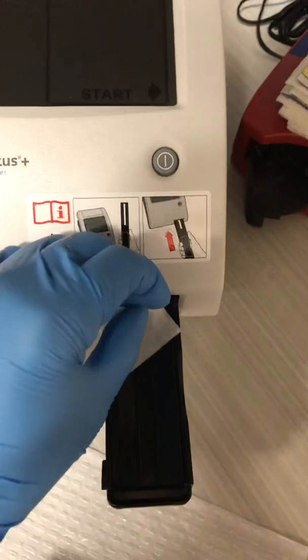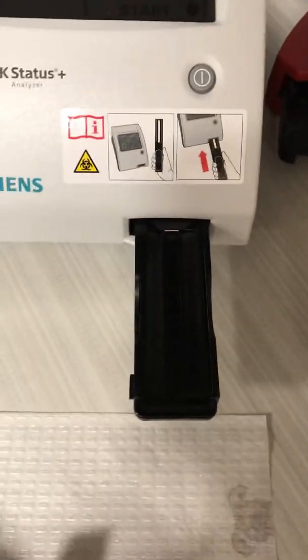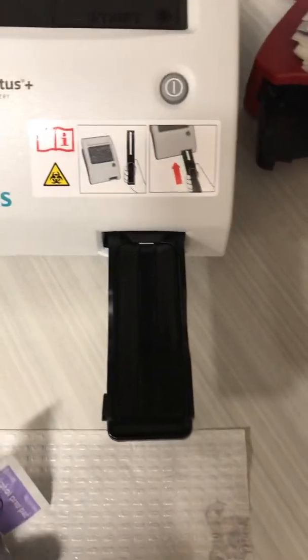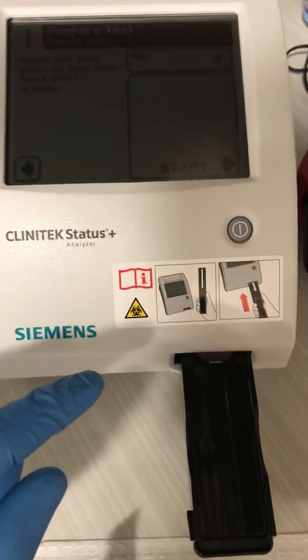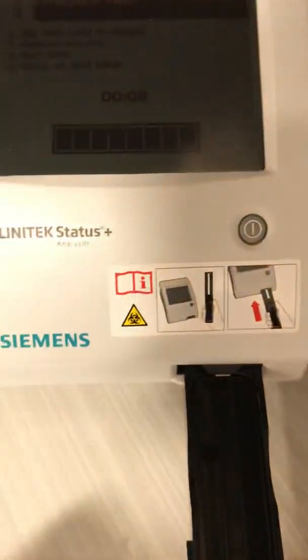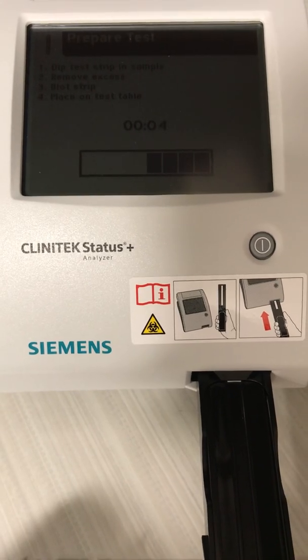Before you click start, make sure you have an alcohol swab and wipe out and clean the cartridge — the area where you're going to put your test strip — so it will not be contaminated with old urine. Then you click start.